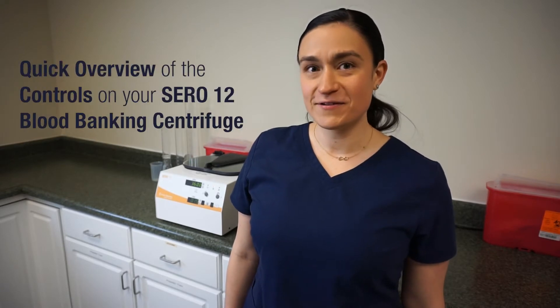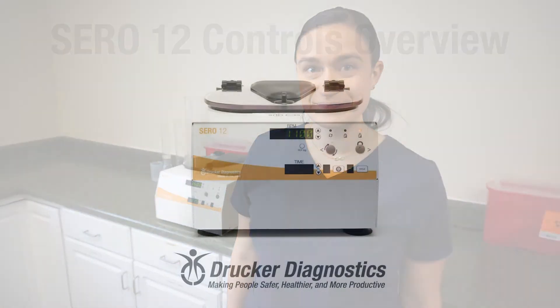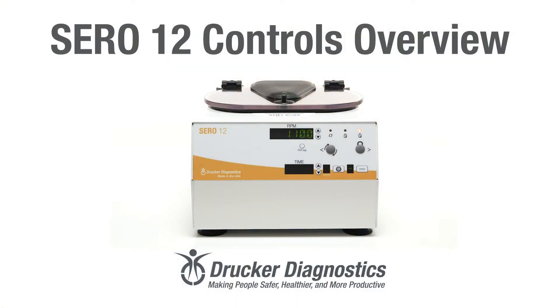Hi, I'm Dawn with Drucker Diagnostics, and today we're going to do a quick overview of the controls on your SERO 12 blood banking centrifuge.